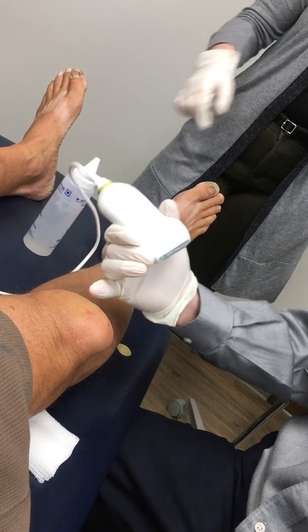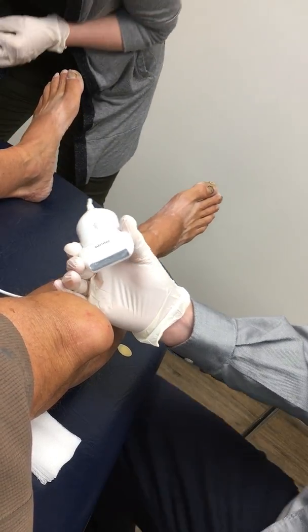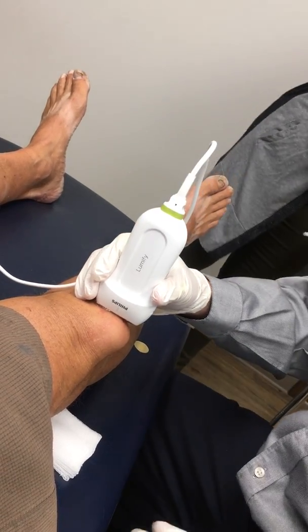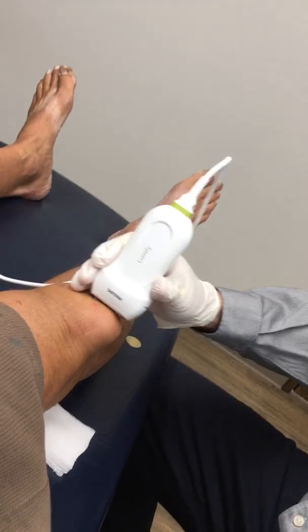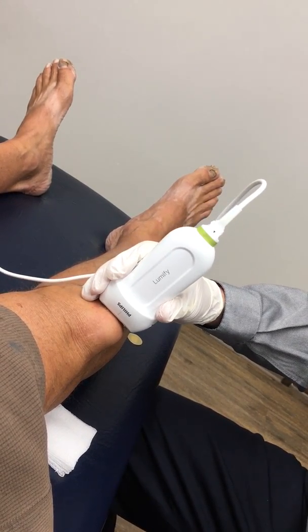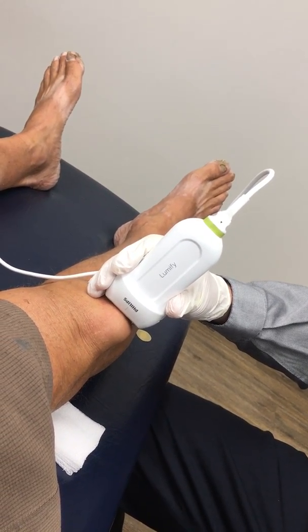So we're going to try to relieve some of the tension from this major prepatellar bursitis. We're going to use ultrasound. So this is my ultrasound probe. And maybe Larissa, what if I had my assistant come just over on my left side. The interesting thing about Reed's bursitis is it's chronic, so it's really thick and it's really inflamed. It's not just a normal, real simple cyst.